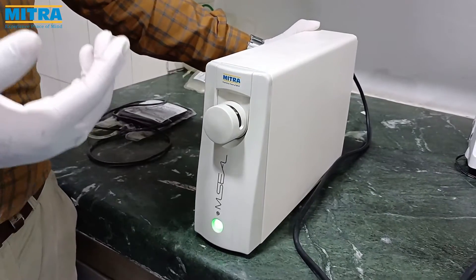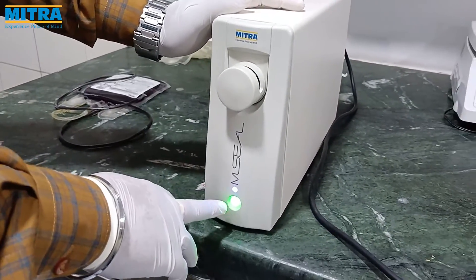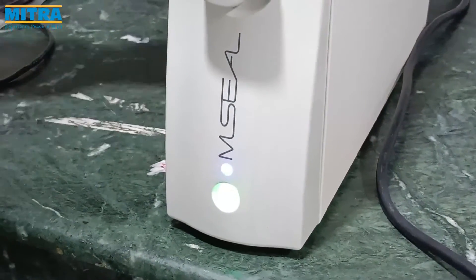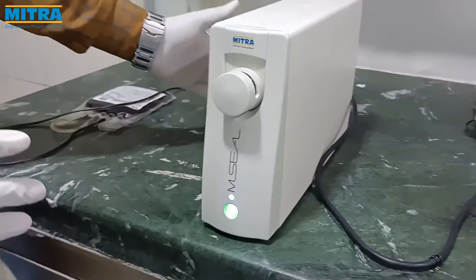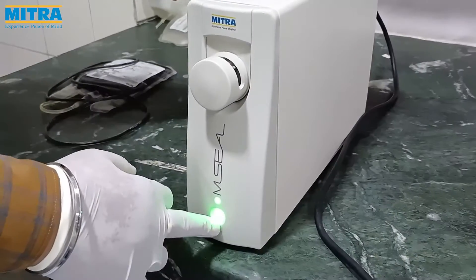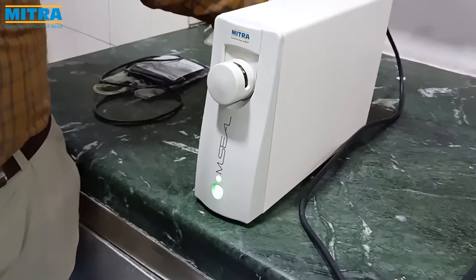Switch on the device in battery mode. The small indicator glows green to show battery fully charged status. Connect the power cord — the small indicator glows blue when the device is running on direct current. The big indicator glows green to show the device is ready for tube sealing.